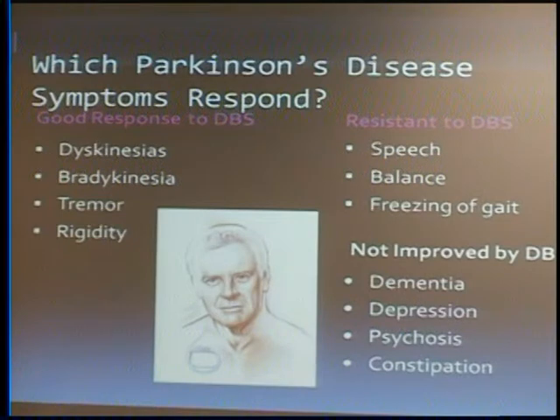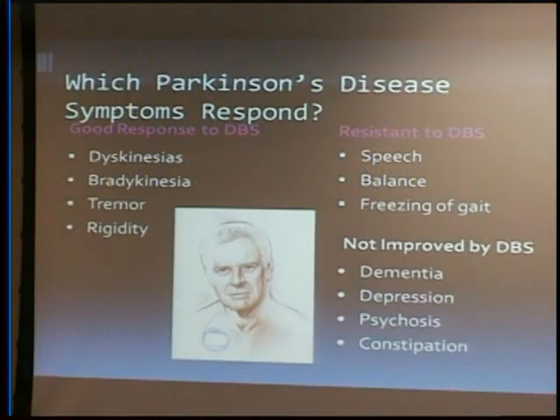The things that are, I don't know that I would use the term necessarily resistant to DBS, but less likely to be helped. We certainly do not expect that we're going to help speech. And for a Parkinson's patient, that is often one of their key complaints coming in. Their voice volume's low. Other people are having a hard time hearing them. Will this surgery make my speech better? We do not expect to make it any better with surgery. And for some patients, depending on the stimulation, we worry we might make the speech a little bit worse, and we might have to adjust the stimulation to try and minimize that.